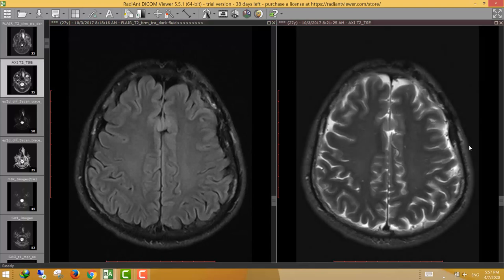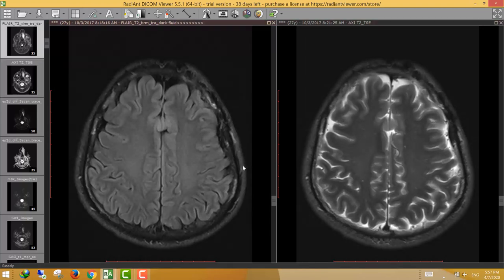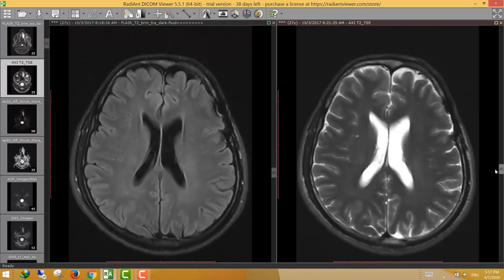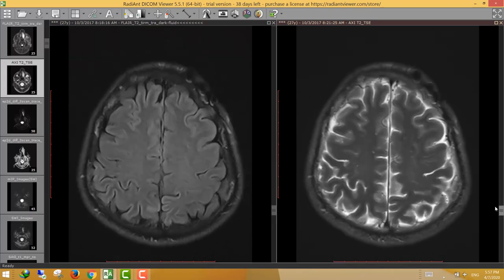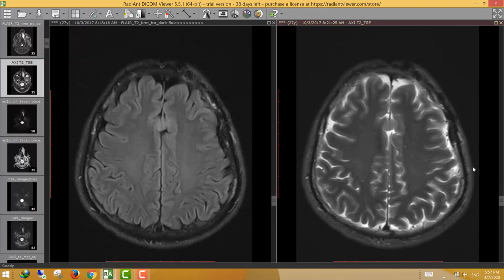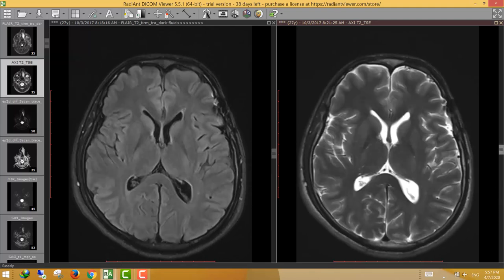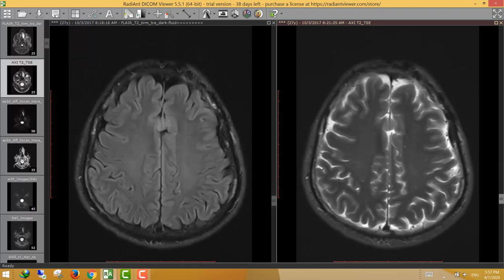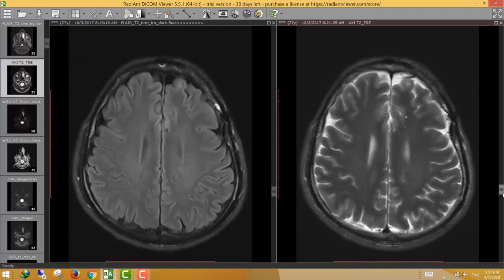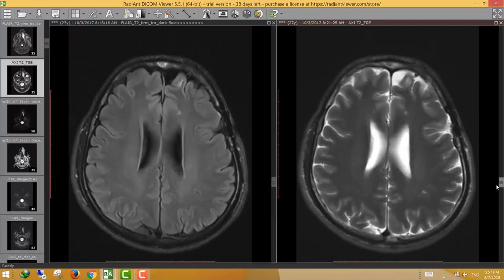Here, these are T2 and FLAIR axial images as usual. We can see there are susceptibility-weighted artifacts — metallic artifacts — seen at the left frontal parietal region, most likely from the previous operation the patient described.